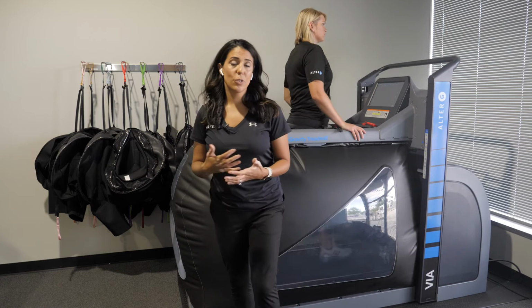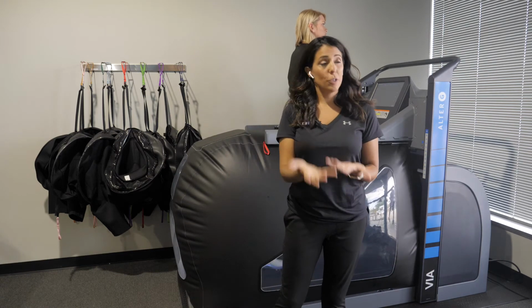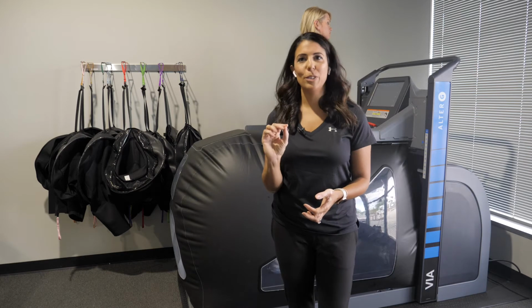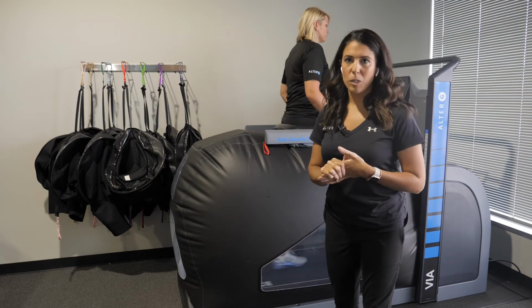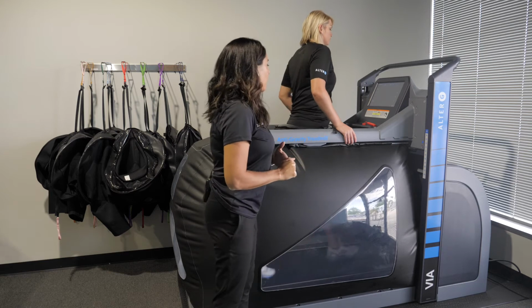So our machines do allow you to make small incremental changes to speed and to the body weight in 1% increments. And this allows you, again, to work with a lower level patient for whom maybe just a 0.1 or 0.2 miles per hour change in walking speed could mean a lot. So there's not going to be huge jumps in speed. It does give you the capability of doing it in small increments.